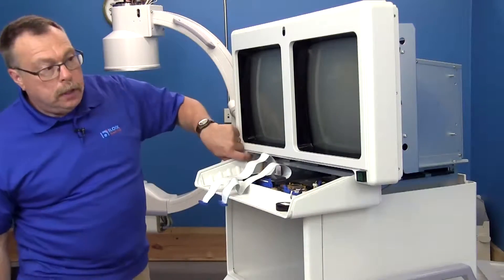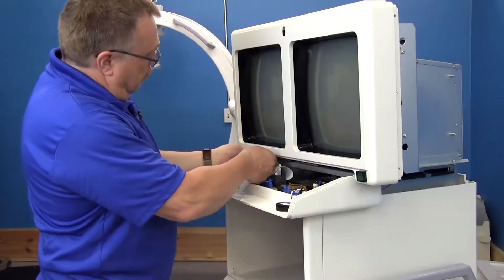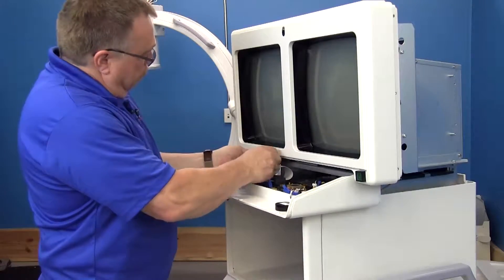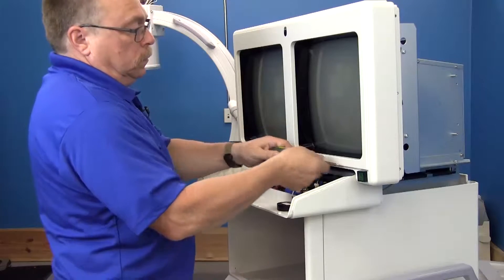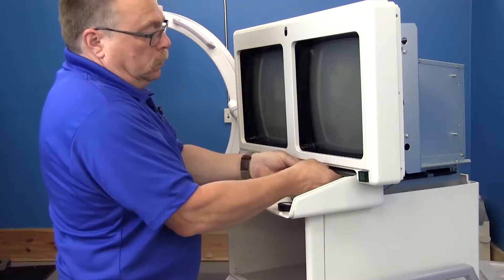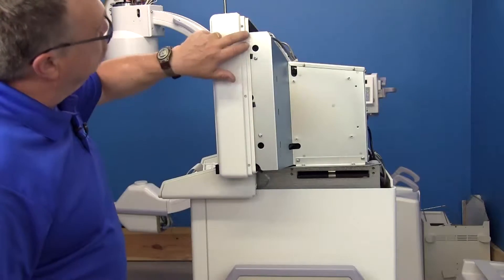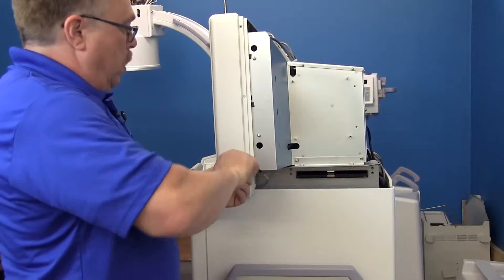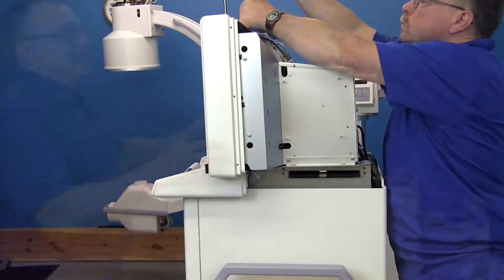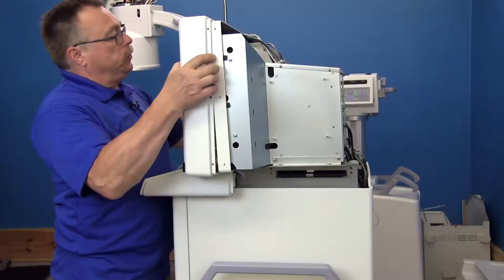You're going to have two Phillips head screws on either side that you want to take out. Sometimes there's also a screw right in the middle. The monitor finisher has screws on both sides and across the top — all of these have to come out. Once all the screws are out, you can pull this finisher forward just a little ways.